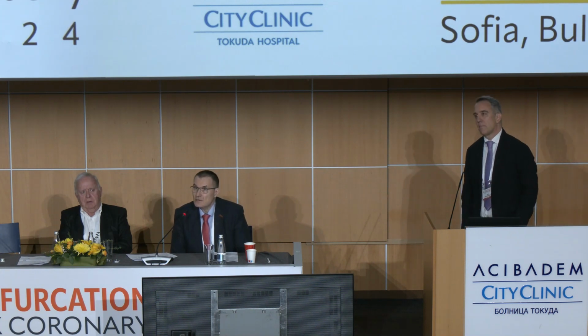So now we have to be, and I'm talking this loudly because in general people do not notice the radiation. You cannot see it, but it is affecting us all the time, and we should be aware of that. Especially for complex patient operators with long procedures, where there is really a high radiation dose. It's a very important thing, the radiation.